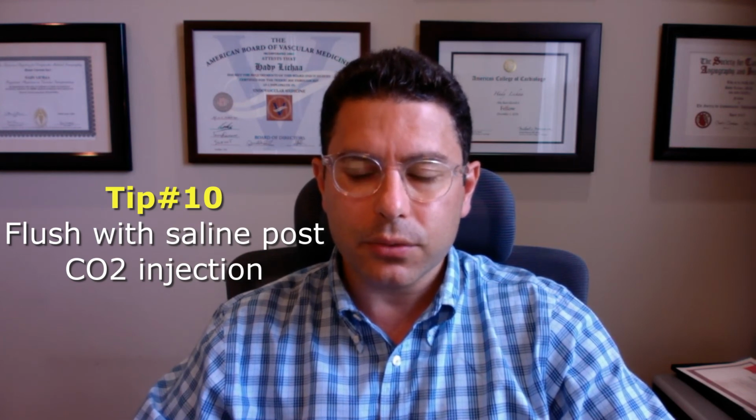And tip number 10 is if you're connected to the interventional sheath and you injected CO2, make sure you flush saline right after that. I personally hook up the system to a pressure line with saline flowing after I inject CO2, because even with a therapeutic ACT, you can still have thrombosis of the sheath, and this has happened in multiple instances. So be careful about remembering to flush the sheath after CO2, and don't keep CO2 in the sheath for the duration of the procedure. And these are some tips and tricks.